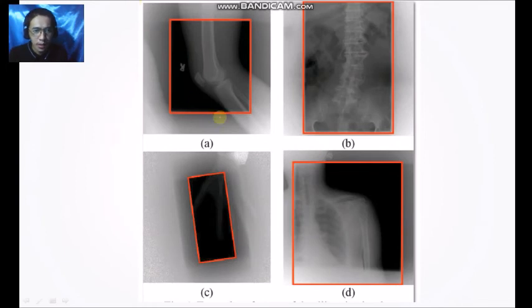Okay, so again, it's related to the exposure field recognition. If this is the whole of the imaging plate, even if the whole plate has been scanned, it should only be the collimated area that is displayed on the monitor.